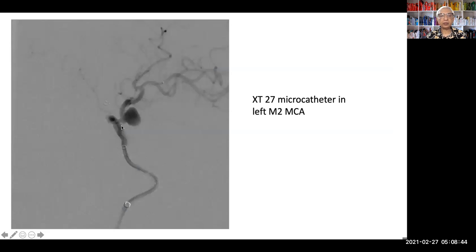and we are ready to deploy a flow diverter. But remember, this is also going to be a big challenge. We cannot see the anatomy in one view. We had to use a biplane in multiple views. And we also did not want to cover the ACA out here, primarily because I said the spasm can induce a stroke where collaterals will drop, and we were not very keen to do that.